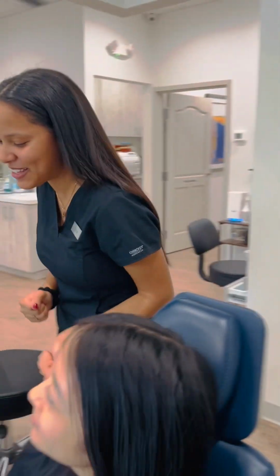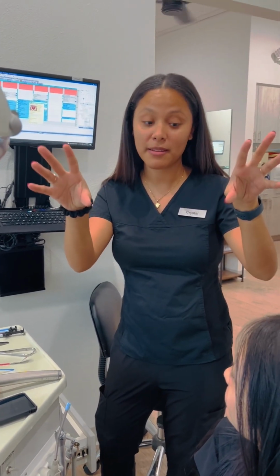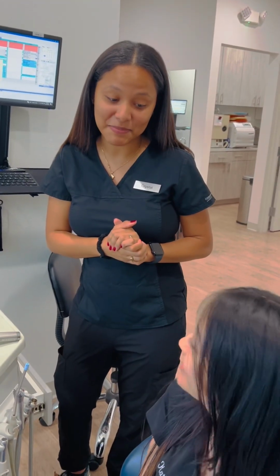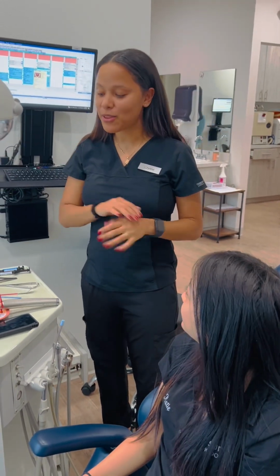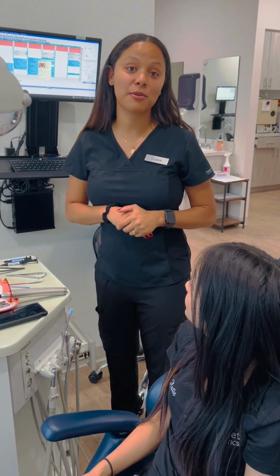I got everybody here learning, and you, whoever's watching, and we are going to put braces on and start the start appointment. This is a start appointment on our patient, Emily. You're Emily today, and so going through the whole process. She actually works here, but we're going to treat her like she was a real patient, okay?